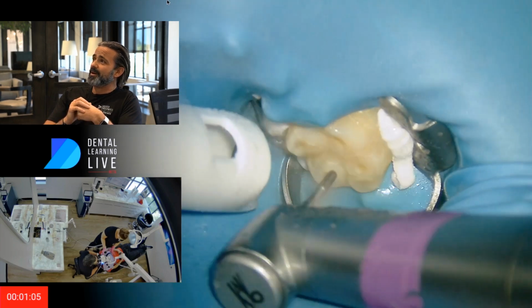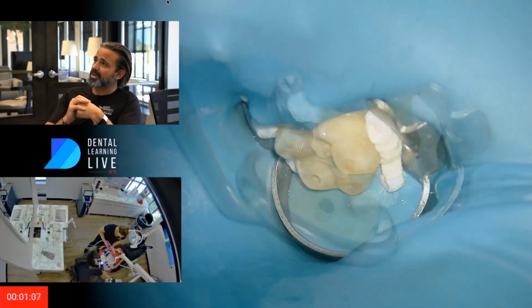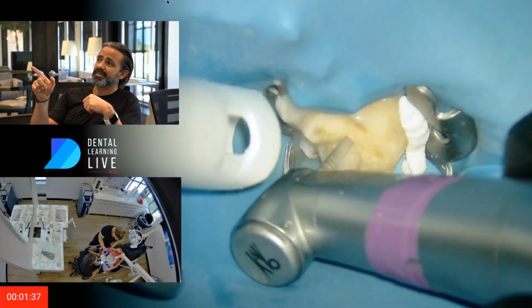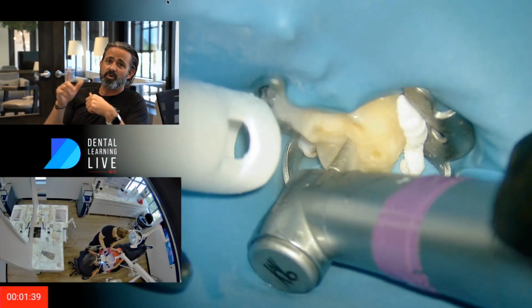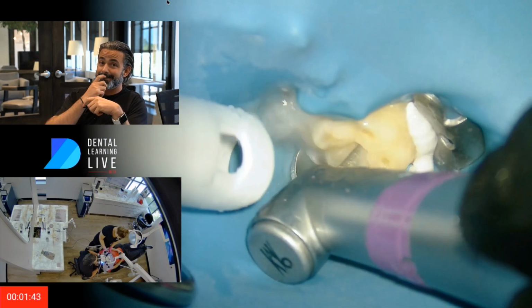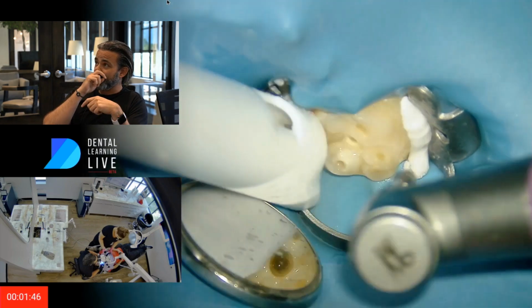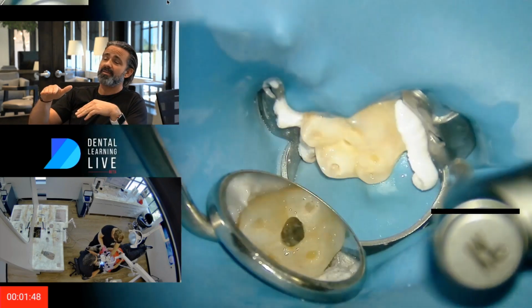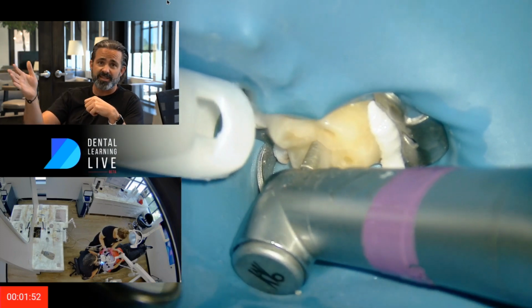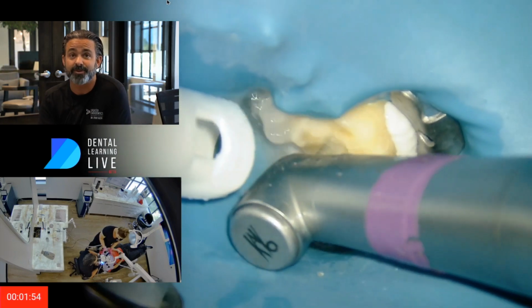So traditional access, you'll see that going on here. By the way, before we get going too far, in the bottom left-hand corner of the screen there's a red box, and that's actual clinical time. Everything you see in that box is time-stamped, so the timing of what's transpiring here is actually accurate.